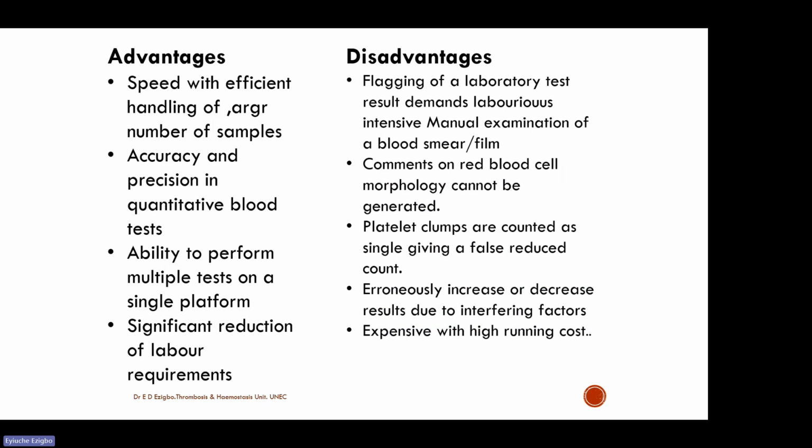Automation is very good because of the speed, with efficient handling of a large number of samples. A large number of samples can be handled. It is accurate and precise for quantitative blood tests. It's more accurate than human error.